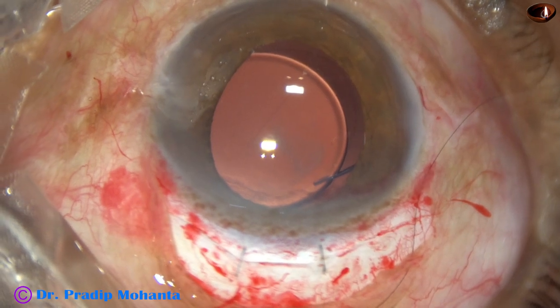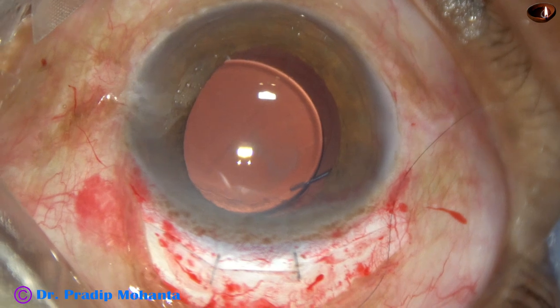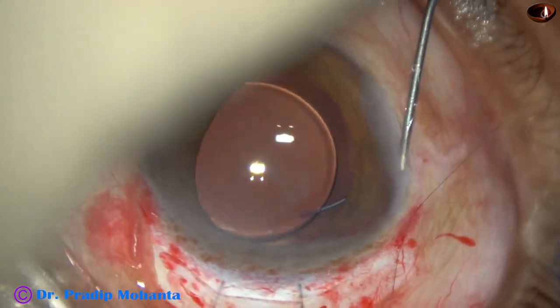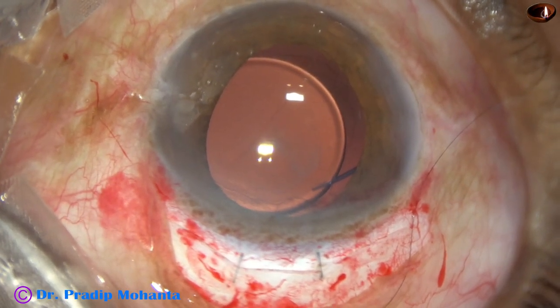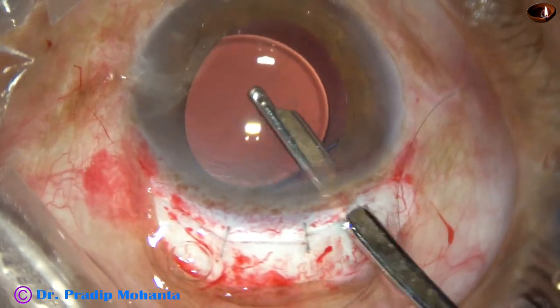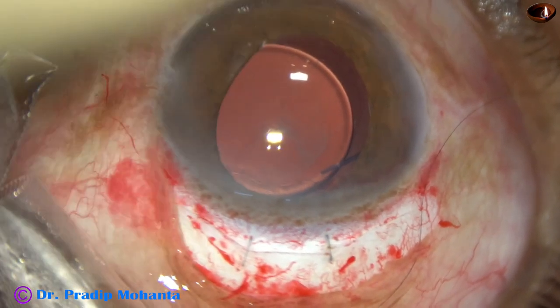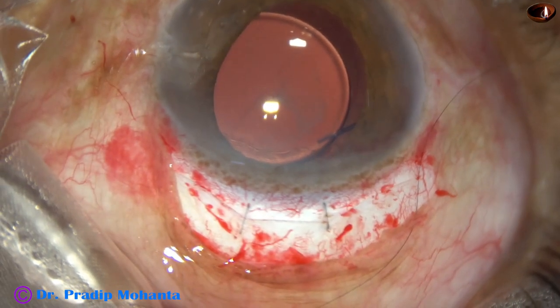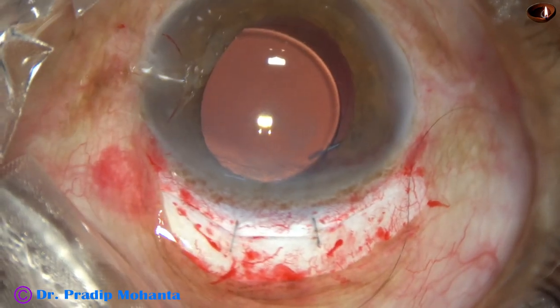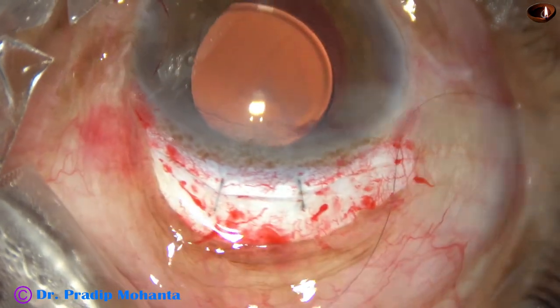And now this is a bit of moxifloxacin. The side port is closed by hydrating corneal stroma on either side of this stab incision, and then a final lavage of the anterior chamber. So I am going to ensure that there is no visco in the anterior chamber. And just see, such a large wound and only two sutures, minimal astigmatism or no astigmatism at all because of these two sutures. So this is a very good modification of extracapsular cataract extraction.